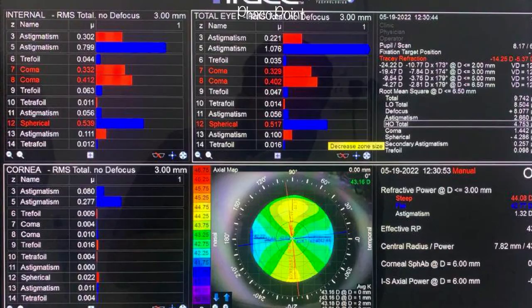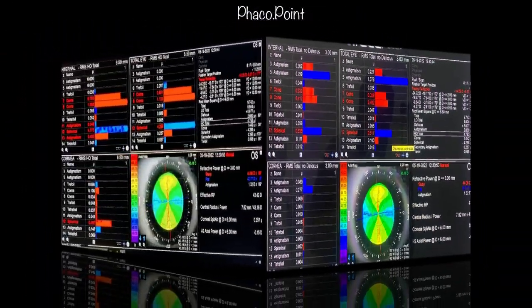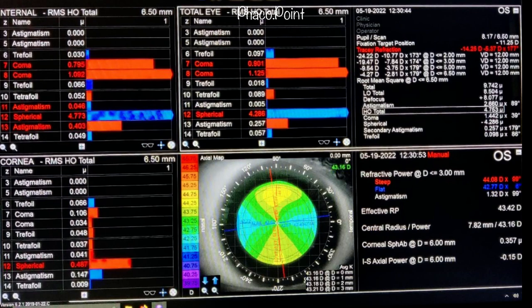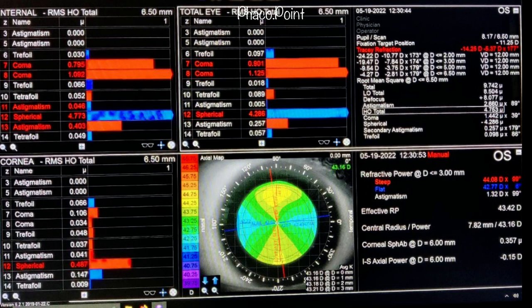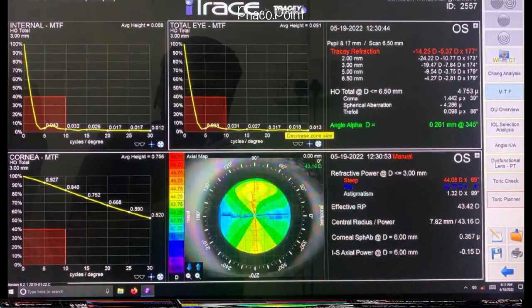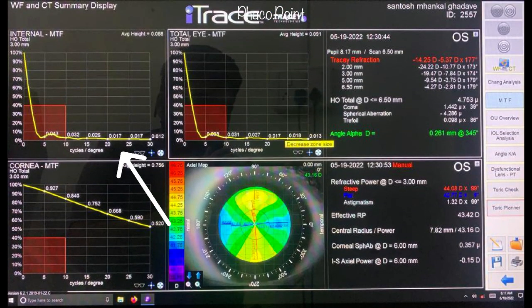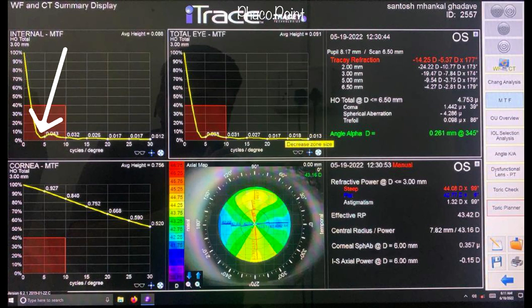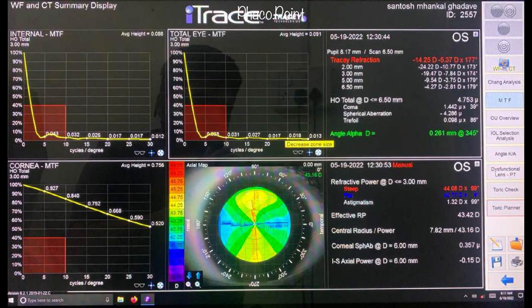Spherical aberrations are known to cause glare, halos, and night myopia. There is also significant coma in the internal optics — in the lens. The presence of coma generally indicates that the lens is decentred or tilted, and coma is often the cause of blur and double vision. The internal modulation transfer function reveals a huge drop in the overall MTF. In this patient with very early nuclear sclerosis, the intense drop in MTF is possibly the result of the anterior lenticonus itself.